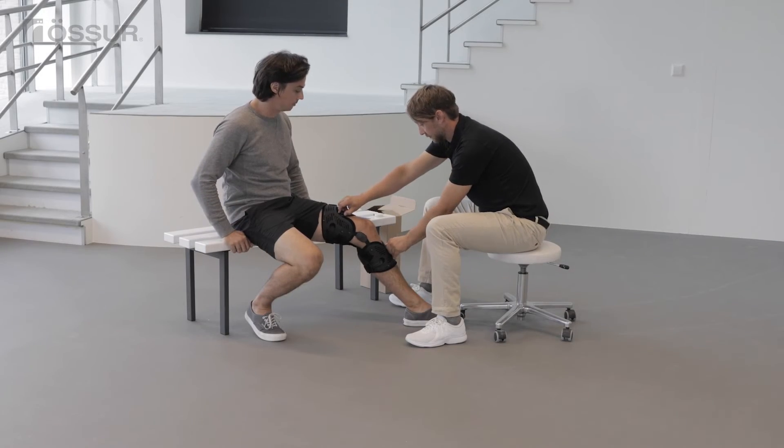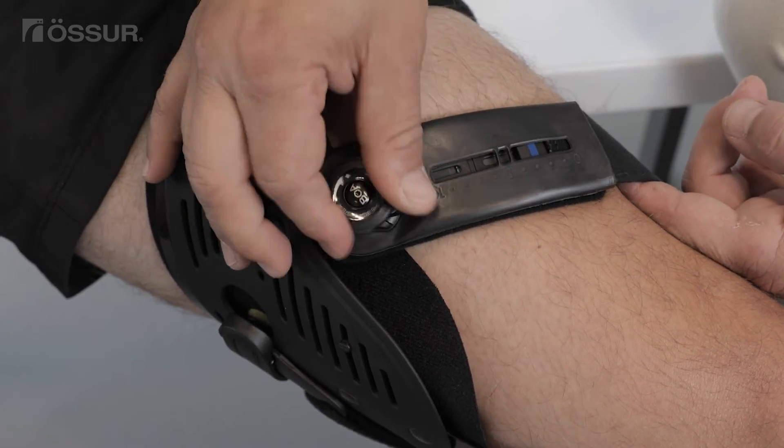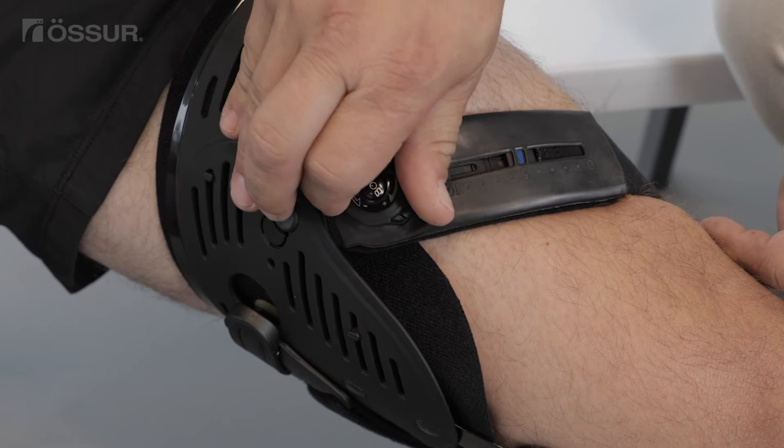Bend the knee. Turn both upper and lower smart dosing dials clockwise until the blue indicators are in the middle position.